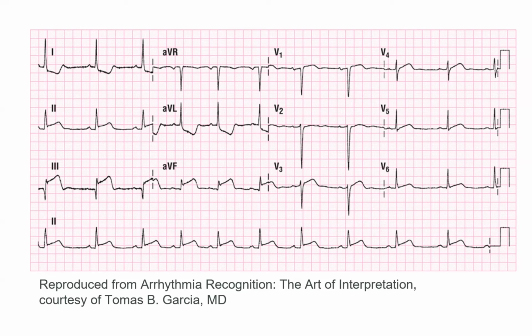So that's where we measure our elevation from, this baseline right here. We say that's our elevation. I'm not picking on you. Same thing here. That's our elevation. So we got more than 1 box in all 3 of those leads, yeah? So we're looking really good, because you got inferior elevation with lateral depression, right? Yes? Am I making this up? Yeah? Okay, thank you.